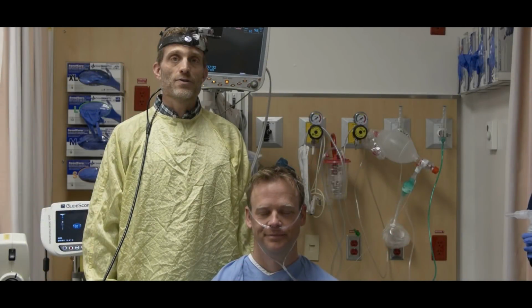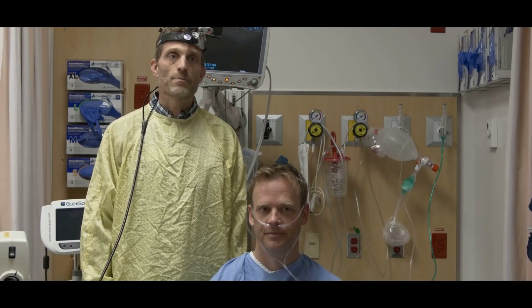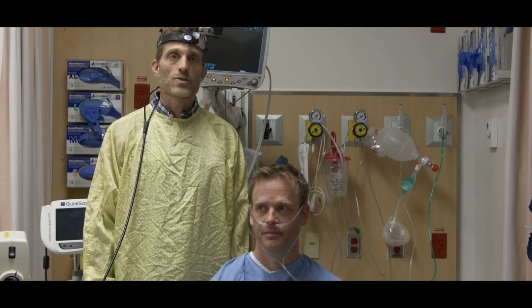So here we are in the Foothills Emerge. My name is Gavin Greenfield. I'm an emergency physician, and I'm a STARS physician as well. And I have Chad Heggie here, who is a STARS paramedic. Been there for a long time. And we're going to demonstrate an awake intubation.